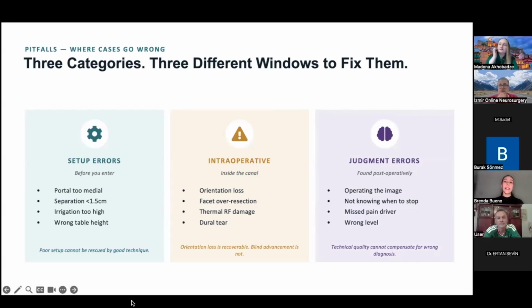And of course, dural tears. Everybody is exposed to having dural tears. The way that I manage it: if you have neural structures as content, and the tear is less than 5 millimeters, just observation. If it's between 5 millimeters and 1 centimeter, I put Tachosil or Duragen or even fat of the patient and continue, or sometimes I do a suture.